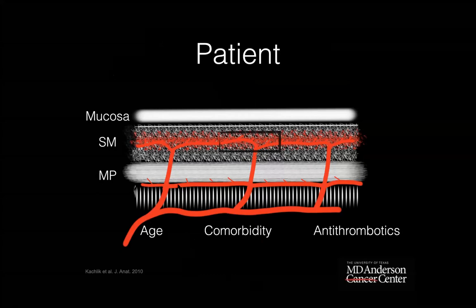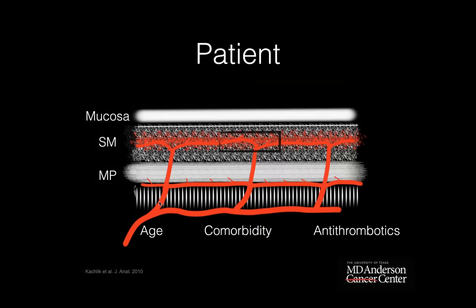You have basically three, this is the arterial supply to the colon as it penetrates through the longitudinal layer. There's one plexus that stays here in between the circular and the longitudinal layer. And there's a larger plexus in the submucosa. And then there is a smaller plexus in the mucosa that actually helps you to define the type of the polyp. The brown areas that you see when you do NBI are the capillaries as part of the mucosa plexus.